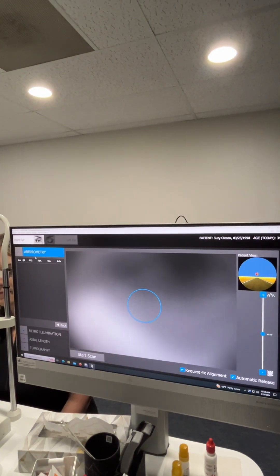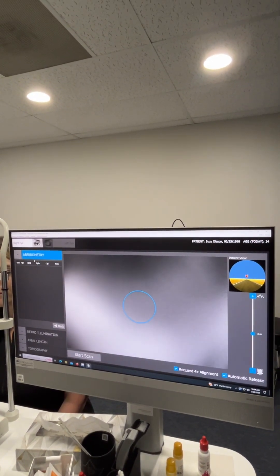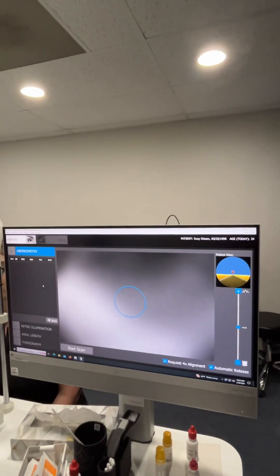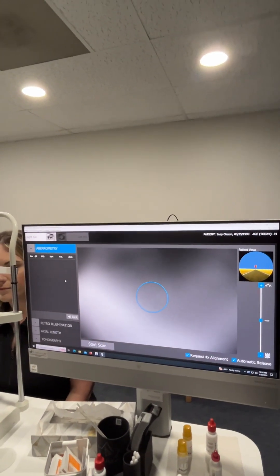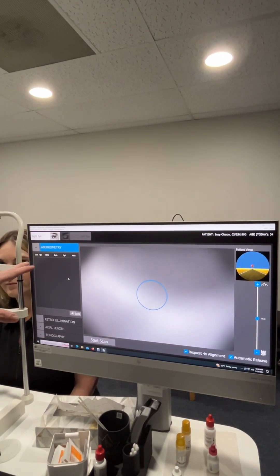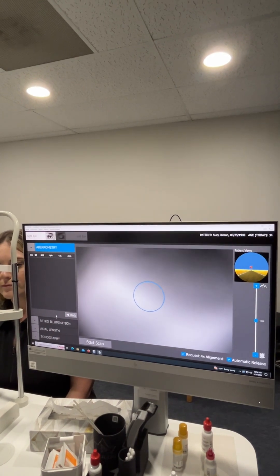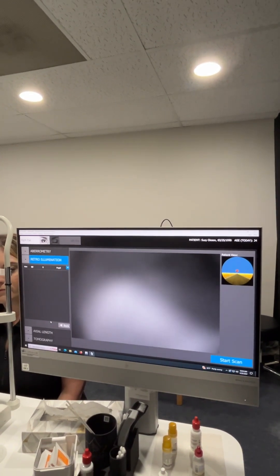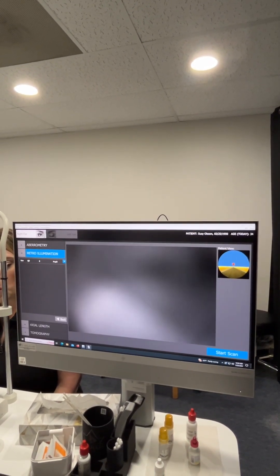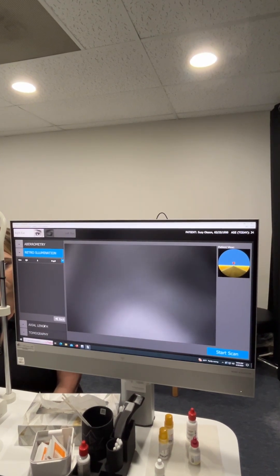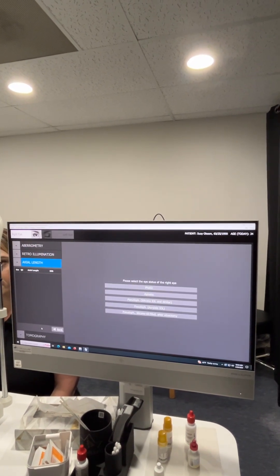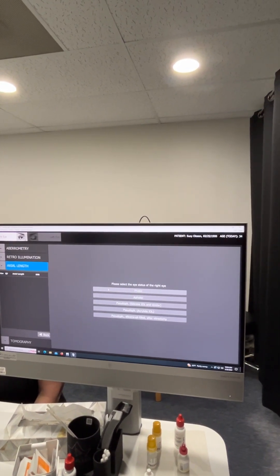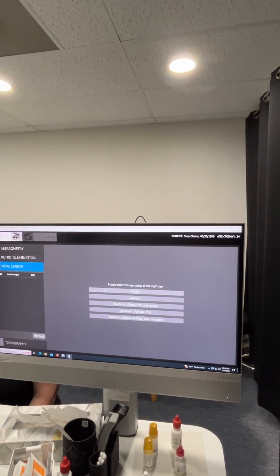So this loads up the acquisition display here and then the different things that we'll do is aberrometry, which will give us a prescription as well. Retro illumination through the pupil and any media, cornea or lens. And then axial length.